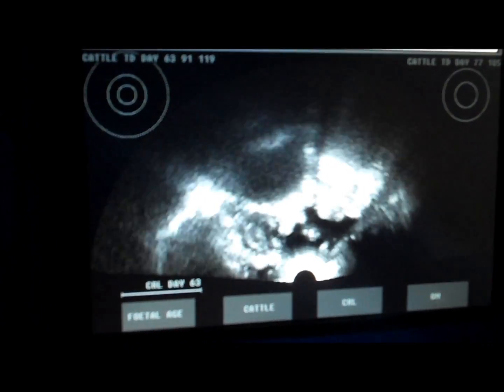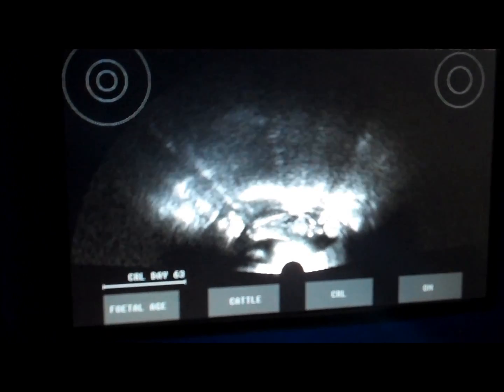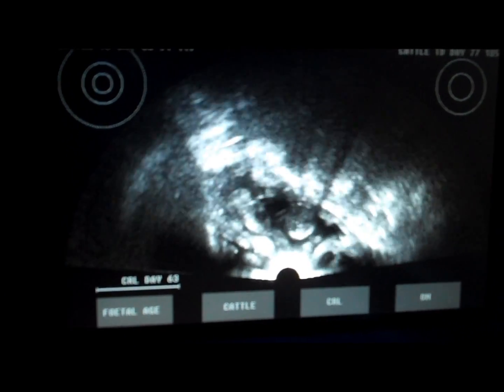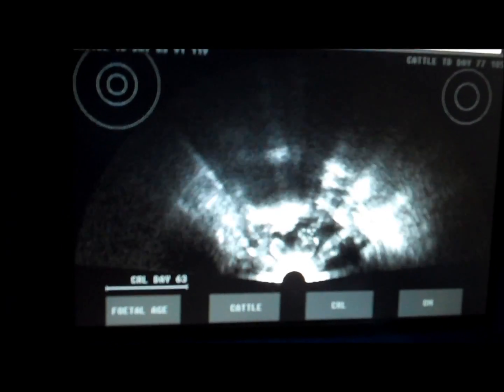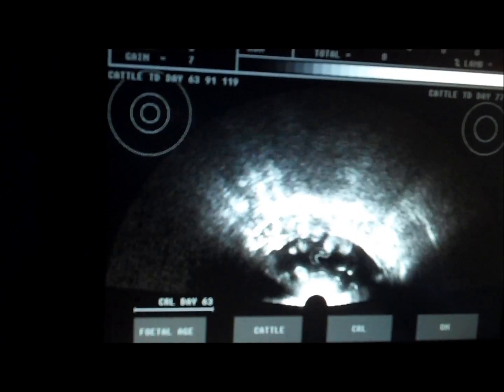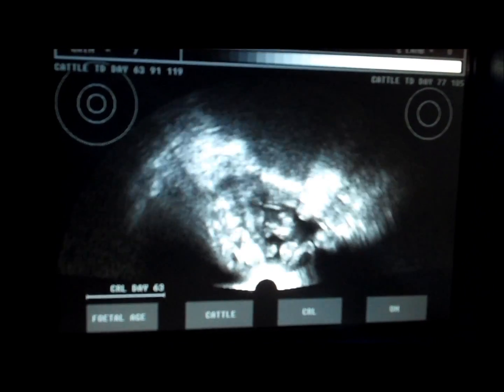Good contact — what we can see on the screen here: the dark areas, which is the amniotic fluid. We're scanning through. Here we have a backbone with a rib cage, with the head to the left. Coming back, we have another body in cross section. And here's the head. The observed donut-shaped areas throughout the pregnancy as we scan through — these are referred to as the cotyledons, which are the afterbursts attached on.